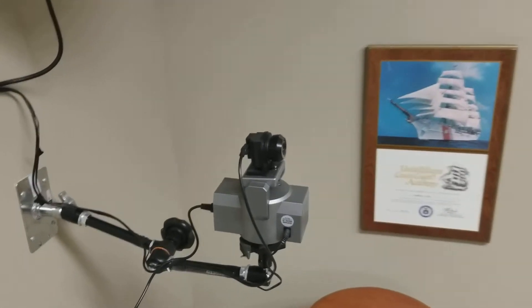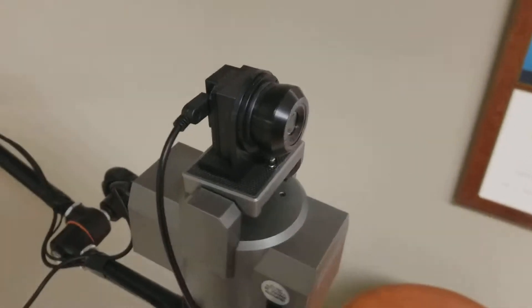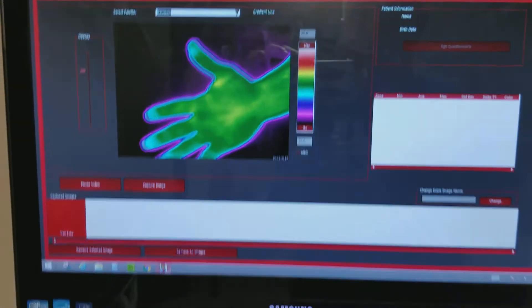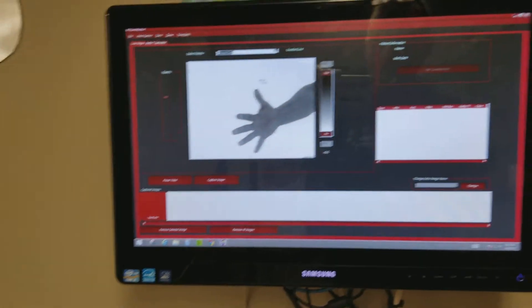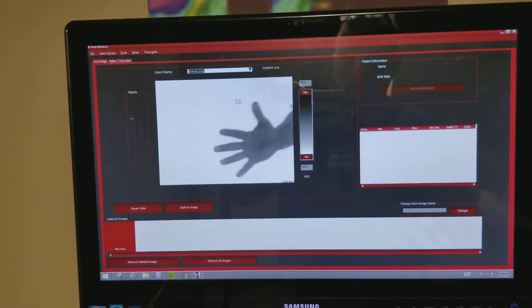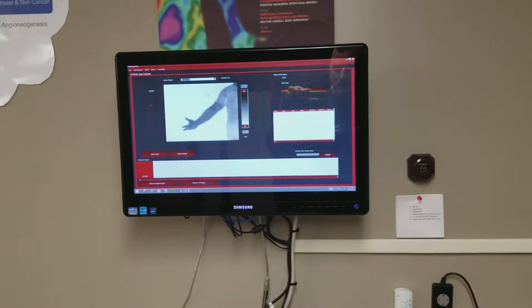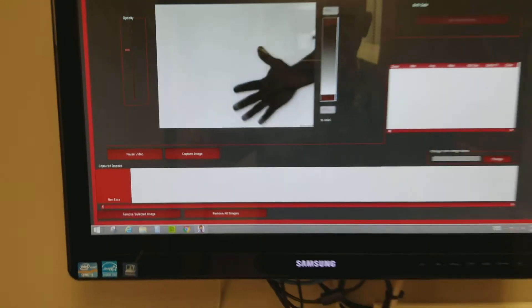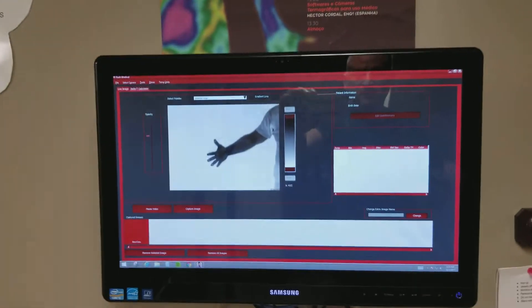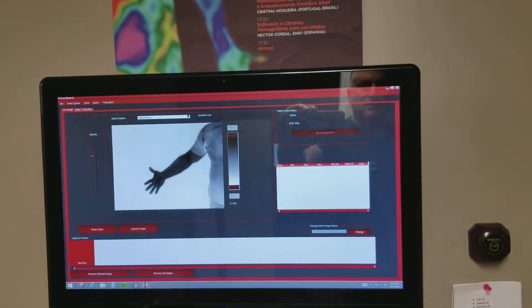This camera quality is the highest quality you can get for under $50,000 — it really is awesome. I'll go to the inverse gray mode. I know everybody likes looking at color, but when you go to inverse gray you really get more detail of what's going on. You can see — I'll show you my arm — and that's not on AGC. We'll put on AGC now and now you can see it, and especially my shirt. Look at the detail and the resolution on the shirt. That's the camera system.